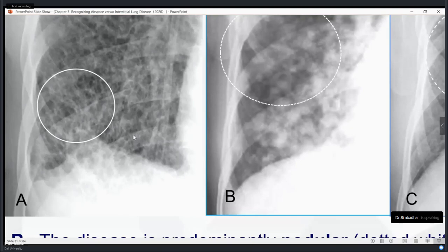They come together, they go together. But here you can see the bronchus, and the opacity surrounding it has more crisscross lines, and this crisscross segregation is not seen within the pulmonary markings. So that is how I know whether I'm looking at pulmonary markings or a reticular pattern.